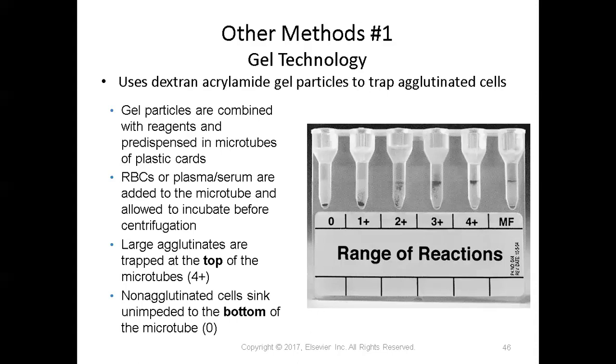And the bad thing about the centrifugation, what I can tell you is when you're centrifuging tubes in tube testing, you heard me talk today about how it's only 15 seconds and we read it and we look for the chunks of agglutination in the bottom of the tube using a viewing lamp and a mirror. 15 seconds is fast. These gel cards centrifuge for 15 minutes. 15 minutes, okay, long time, okay? But here's what we're going to find when we're done.